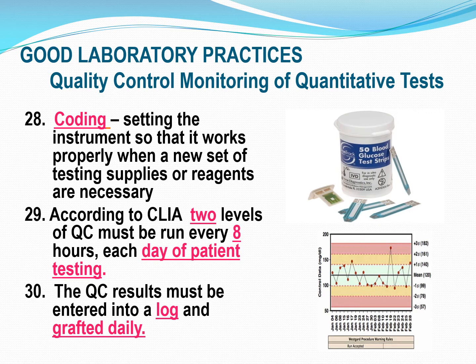And then this is the little coding piece that's right over here to the left, okay? When you open up these new test strips, you would take your instrument, take out the old coding device piece that was in there, and then put the new one in and follow the directions to code that instrument before you started using those new test strips. If not, it will most likely make your controls not work, and then your patient results aren't turning out right. So you always want to make sure your instruments are coded.